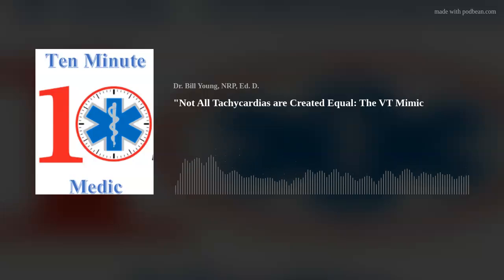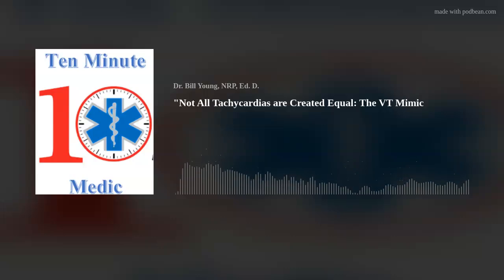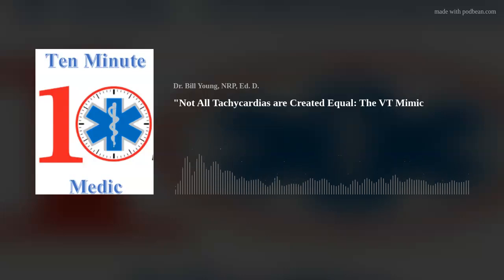One of the defining features of ventricular tachycardia is the presence of a capture or a fusion beat. Again, these are individual beats or complexes that result from a simultaneous activation of the ventricles by both a supraventricular impulse as well as a ventricular impulse. Their absence in SVT with aberrancy strongly supports a supraventricular origin. Carefully examining the EKG for these subtle beats can make all the difference in diagnosis.